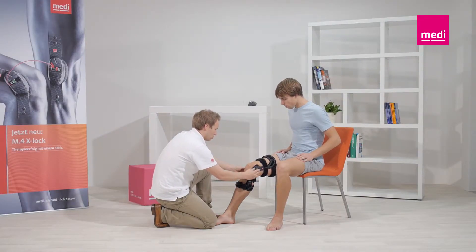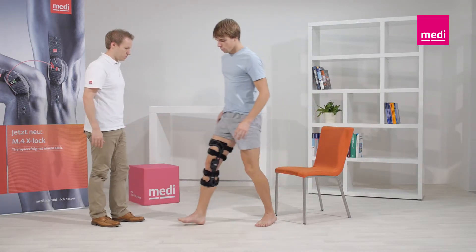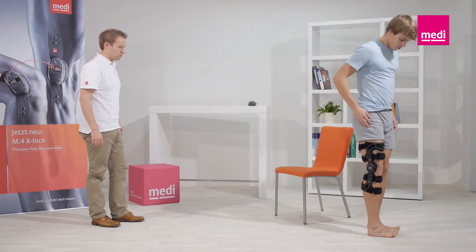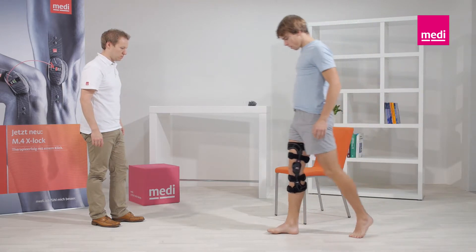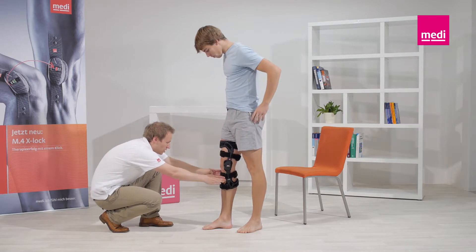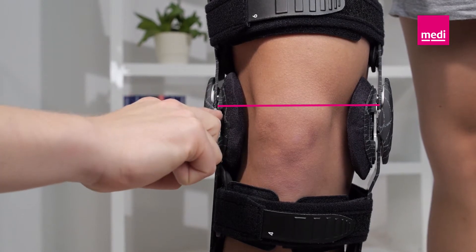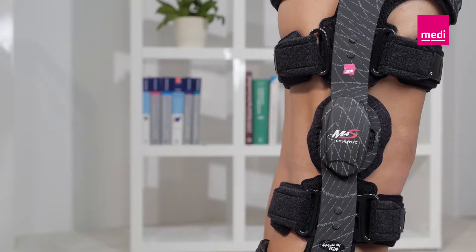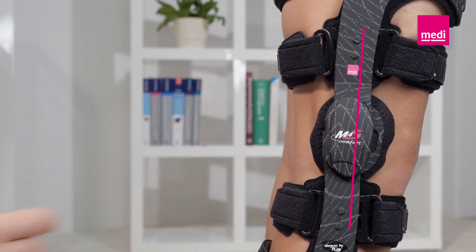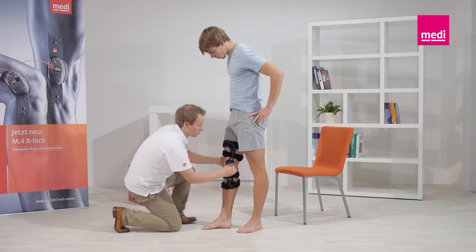It is now recommended to walk a few steps and check again that the orthosis fits properly. The middle of the orthosis hinge should be positioned at the level of the superior border of the kneecap and behind the lateral medial midline of the leg. Then pull the straps tight again in the same order to prevent the orthosis slipping.